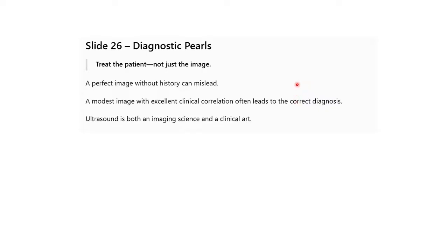A perfect image without history can mislead. A modest image with excellent clinical correlation often leads to the correct diagnosis. Ultrasound is both an imaging science and a clinical art. Take note of that. Ultrasound is both an imaging science and a clinical art.